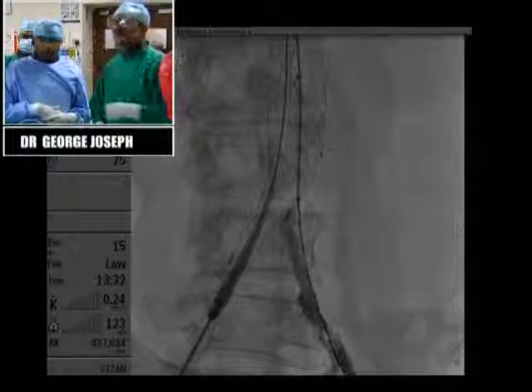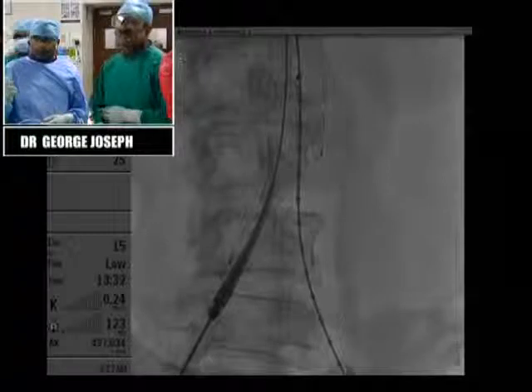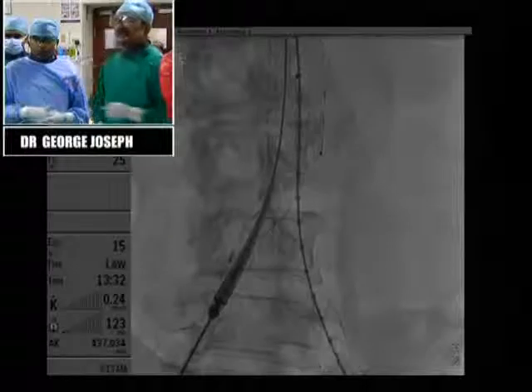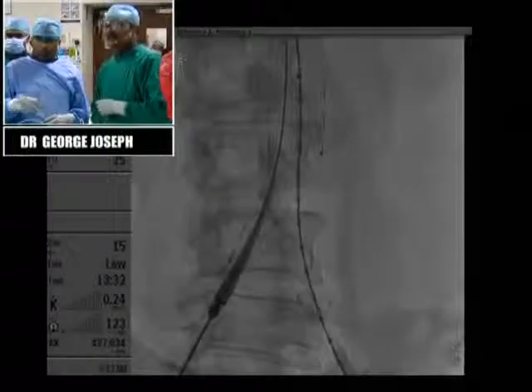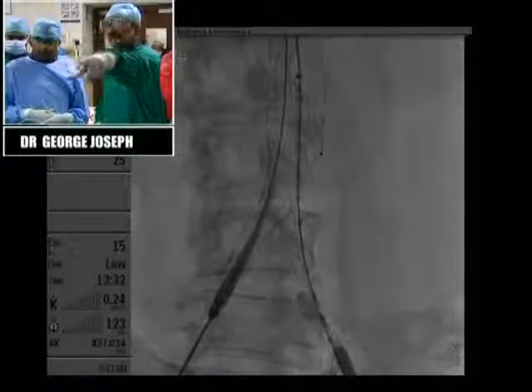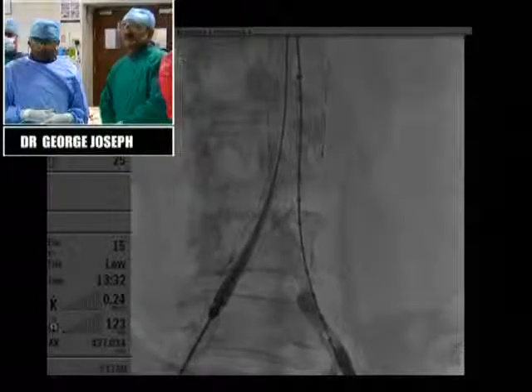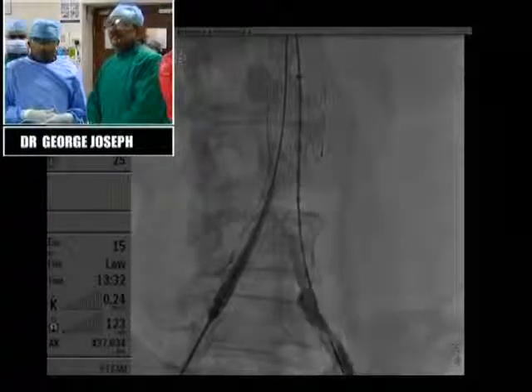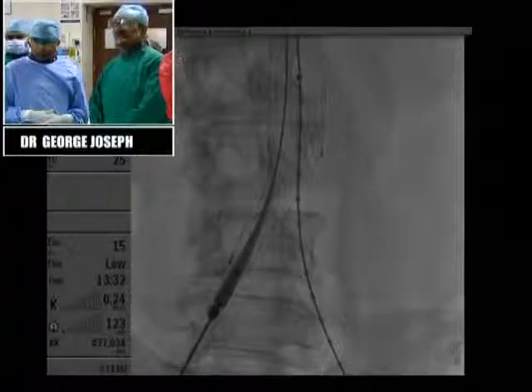Is that some ectasia or something? It's an ectatic segment. There's an angle. See, the other side is much higher, no? So it's okay. Dr. Joseph, I think 8 is safer. I have a feeling that's the internal. The angio you took is now at the same level as the other side. It looks like the origin of the internal is coming higher. I think the internal iliac is in between the lower, second and third mark.